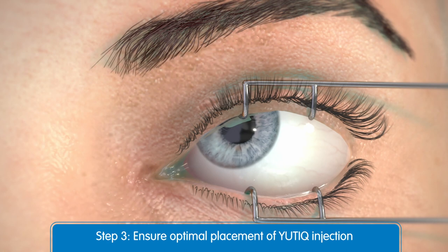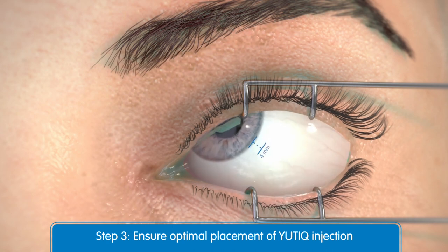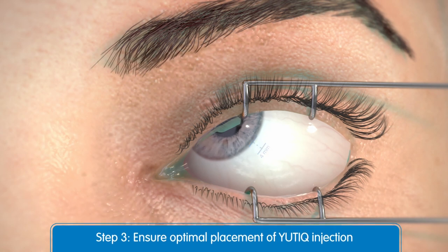For optimal placement, Utique should be injected inferior to the optic disc and posterior to the equator of the eye. Measure 4mm inferotemporal from the limbus with the aid of calipers for point of entry into the sclera.